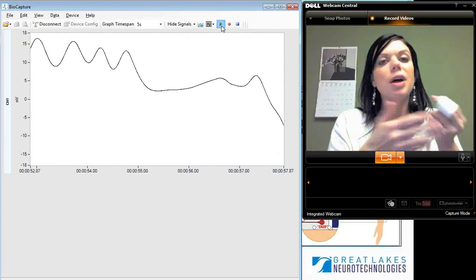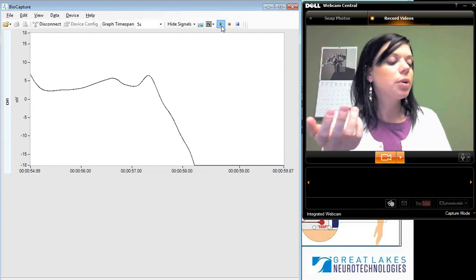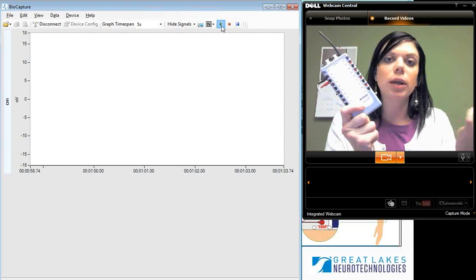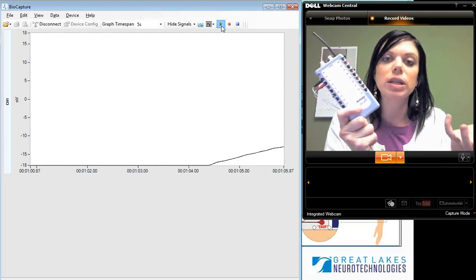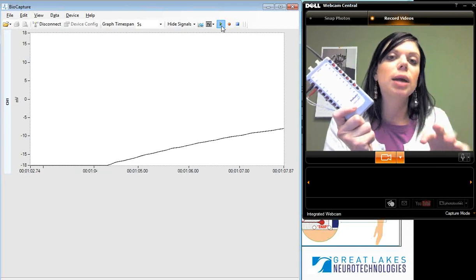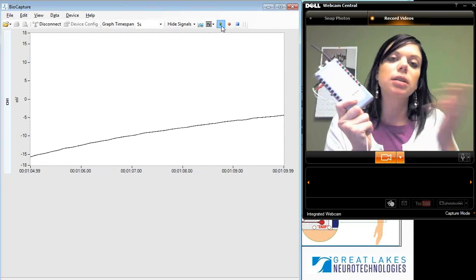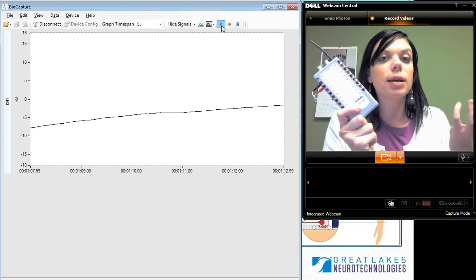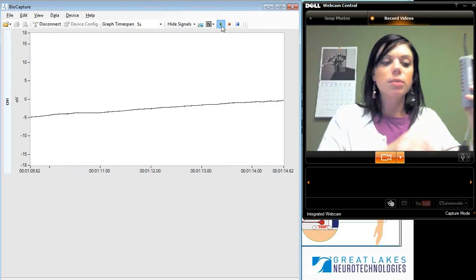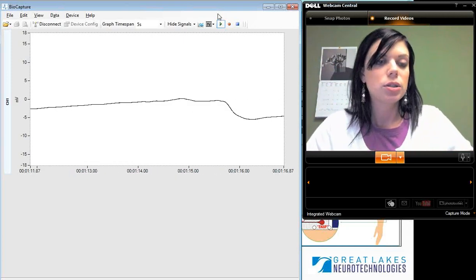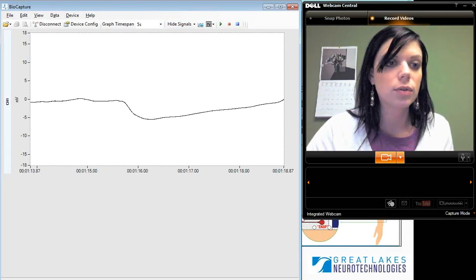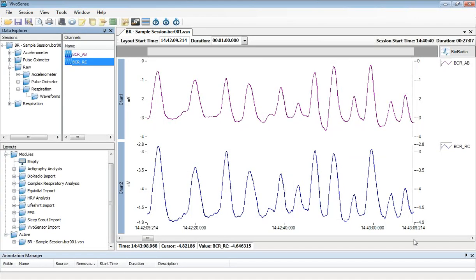The BioCapture software is pretty simple, but it's nice because with the BioRadio you can get up and running very quickly in terms of collecting your respiratory data. Within BioCapture you would save your data files, and then we have a few different options you can use to analyze your data. I'm going to switch over to what we call the VivoSense Analysis Software Package.